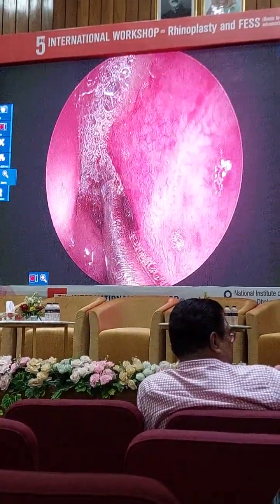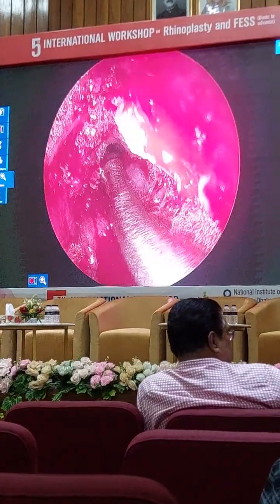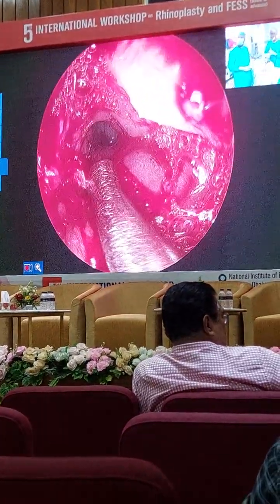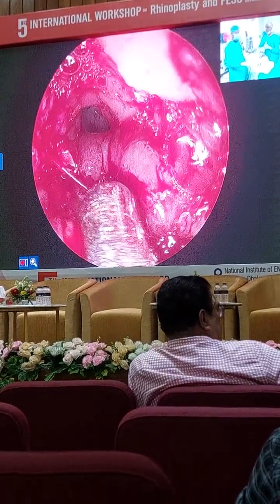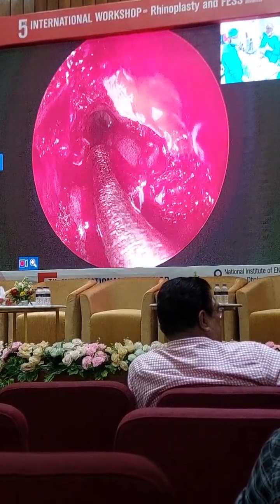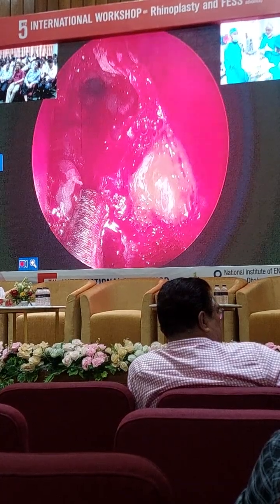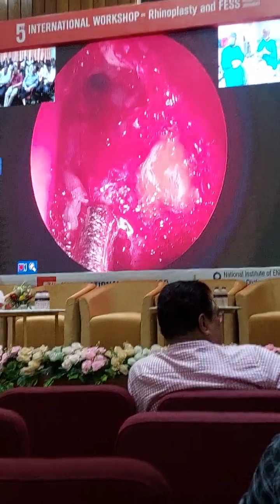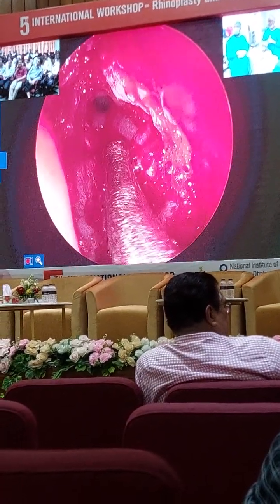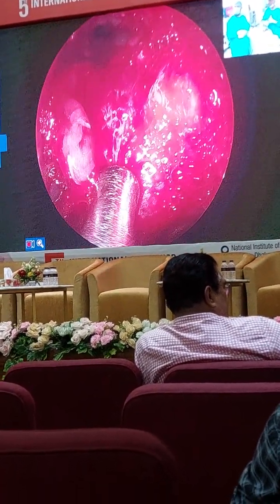Yeah, I know that it's a little dark in there, but that's the same situation we are facing. Okay? Frontal clear, 70? Okay. So all this polypoidal part for me to clear, I need approach from here. Sir, in case of saline wash, which fluid is preferred, sir? Normal saline or Hartmann solution? Normal. So unless I remove my bulla, I can't continue using an angled scope.